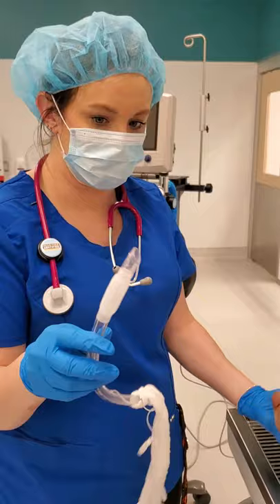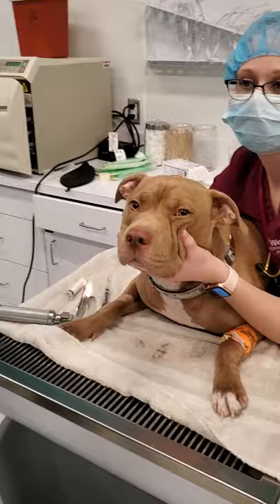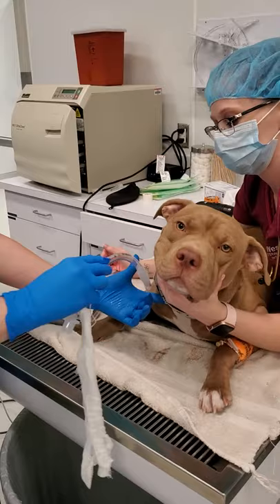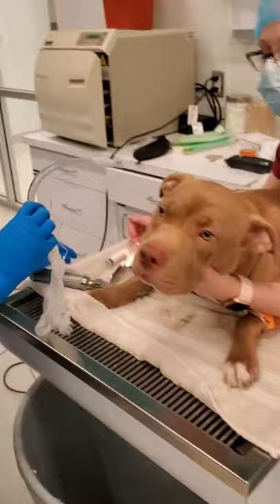I'm going to measure her endotracheal tube. One quick way to see what size to use is to take the end of the endotracheal tube and put it up against her nose. As long as it goes border to border, you should be about right. I also want to measure from her inlet to the tip of her nose so I know how far back I'm putting her tracheal tube. I'm going to move my gauze to that spot so I know where I need to stop.